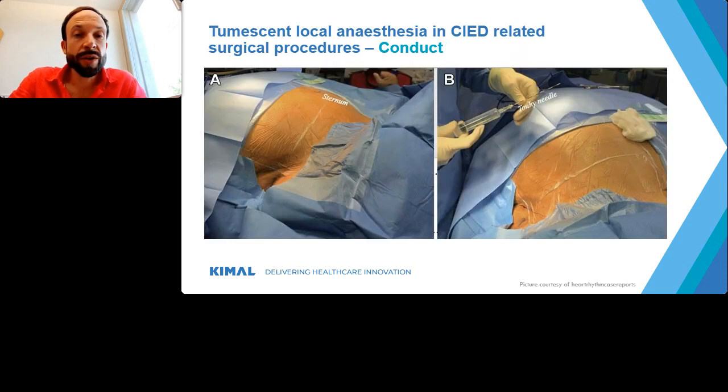So here are the pictures. Again, we're talking about a large area affected, covered with incision foil. There's "sternum" written, so there's an indication that this is the sternal area where the infiltration with the needle is conducted, the first infiltration with 250 cc.